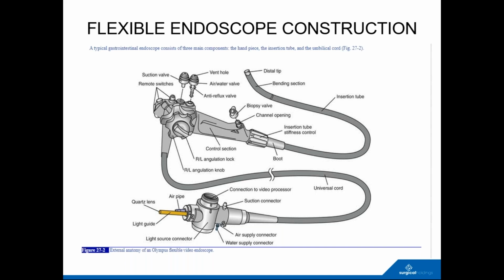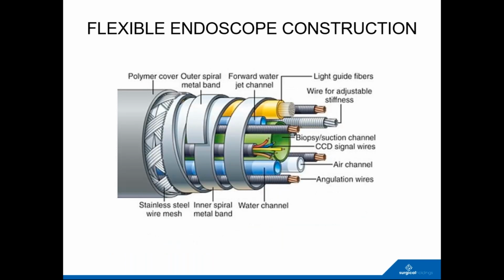And the light guide, you can see the light guide here. Generally, it is a fiber optic way of getting light to it, and so it's something very similar to a fiber optic light guide cable, not a liquid light guide cable, obviously, with the rigid instrumentation. Internally, as you can see from this slide, it's really quite complicated.